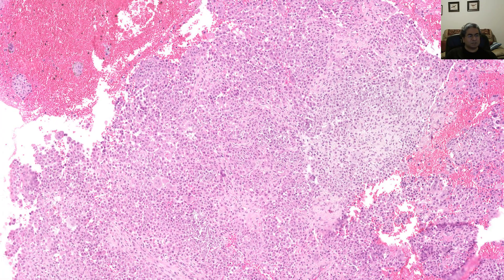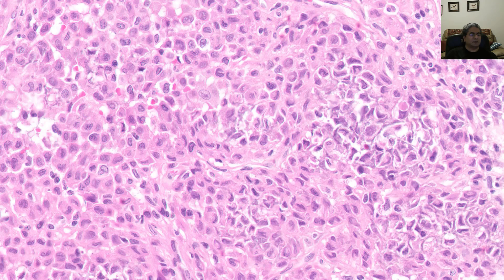When you look at these tumors under very low power, you'll see sheets of somewhat epithelioid-looking cells. Take a very close look at them because they have a very characteristic phenotype.